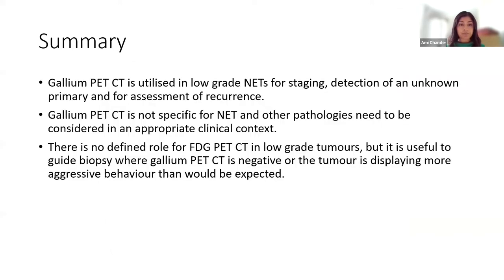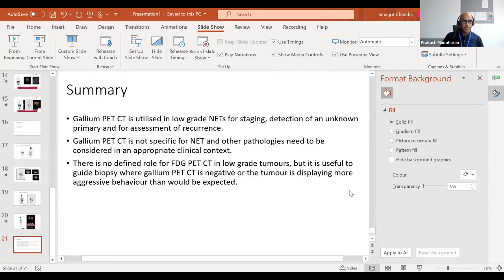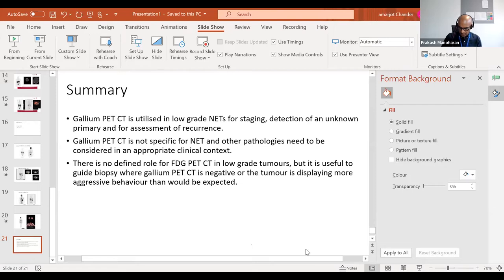Another case: a high-uptake lesion that turned out to be a splenunculus. CT characteristics are very much like the spleen, and on arterial phase CT it would enhance the same way. This should not be mistaken for metastatic disease — it's in close proximity to the spleen here, but after splenectomy, splenunculi can be dotted around the abdominal cavity, so it's always important to keep that in mind. And here: a maximum intensity projection showing physiological pituitary uptake in practically everybody, but with an additional focus of activity elsewhere within the skull — this turned out to be a meningioma confirmed on MRI.